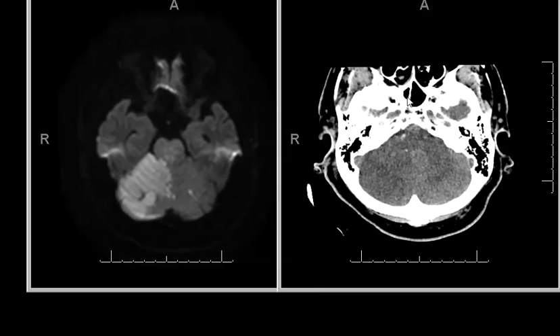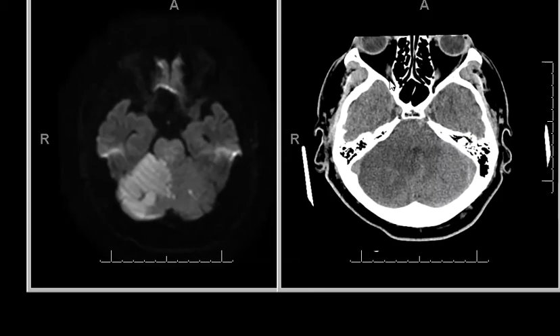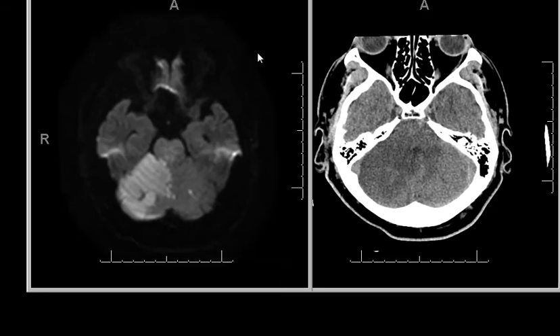And it progressed to the left side. This is another example of even with prompt intervention, stroke still occurred and progressed. So stroke care is very difficult, even with prompt intervention.